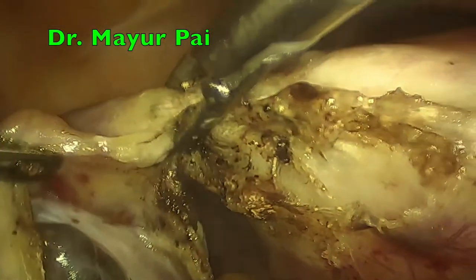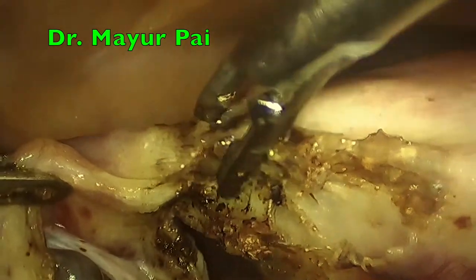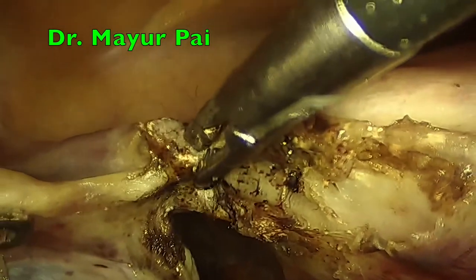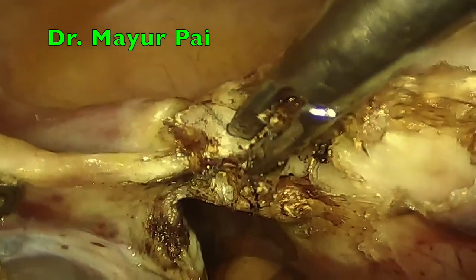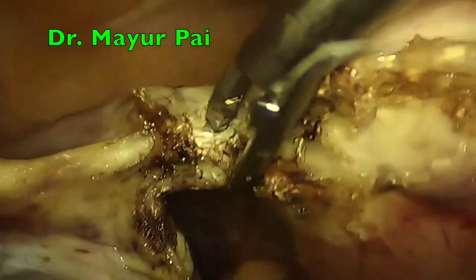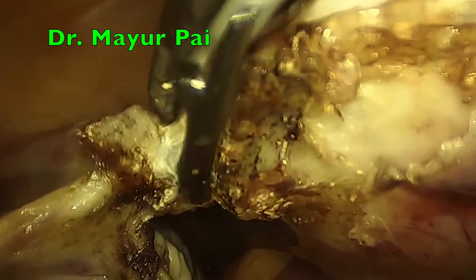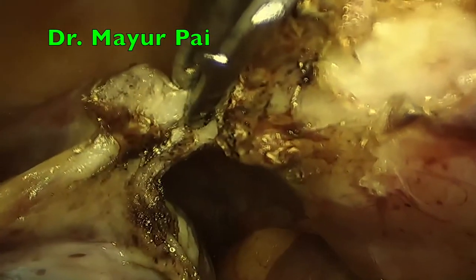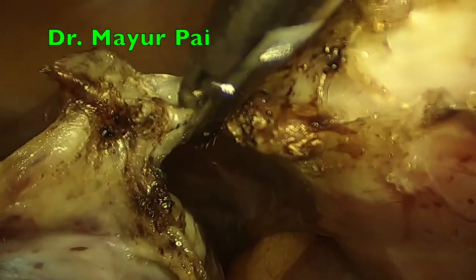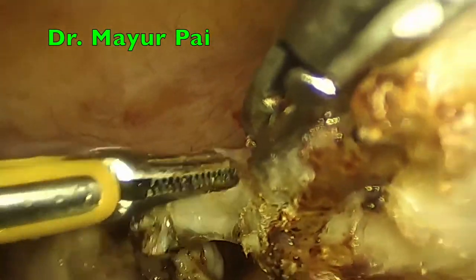The final bit of coagulation is done by the laparoscopic shearer before we cut, but as you can see the coagulation is almost complete and no further bubbles are coming from this area. We always try our best to leave a small stump on the uterine aspect, which protects us from backflow bleeding. You can see that the laparoscopic shearer causes a beautiful dissection to happen and it's fairly quick in doing its work.